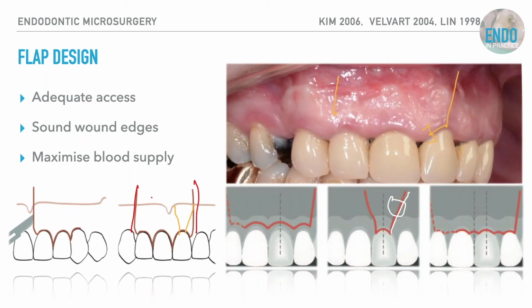is the papilla-based incision. The other incision that I really don't like is the submarginal incision, so this one here. You can see the hideous scarring that it leaves. You're essentially suturing an alveolar mucosa, which is why it's scarring. Again, if you have a large lesion, it's very limiting in the access for it.